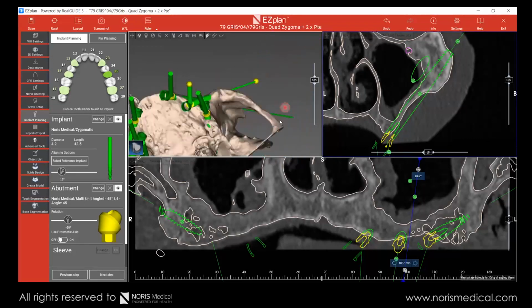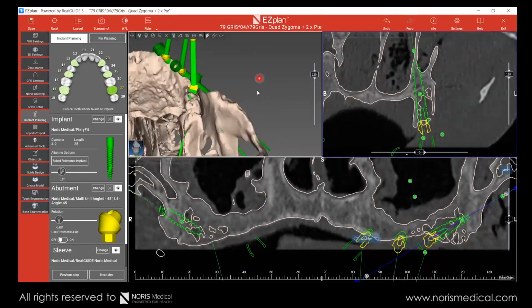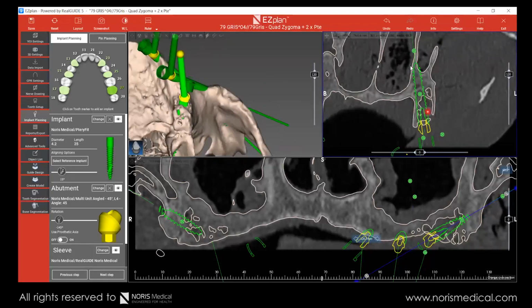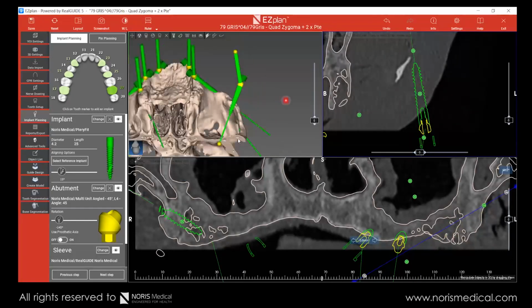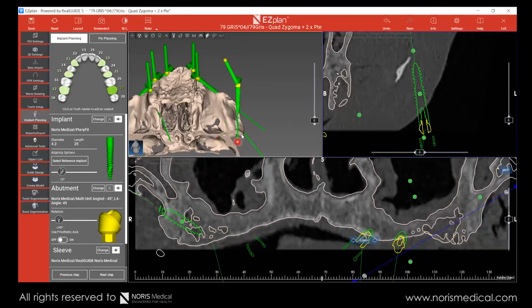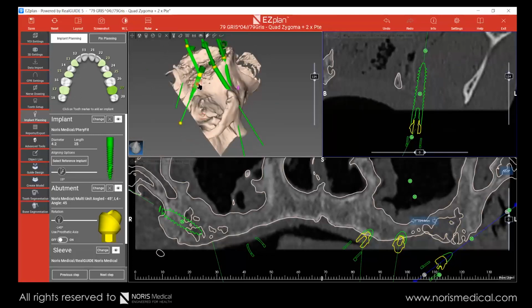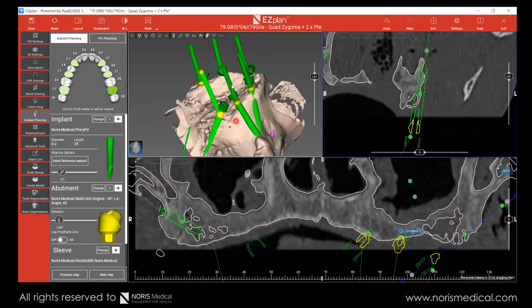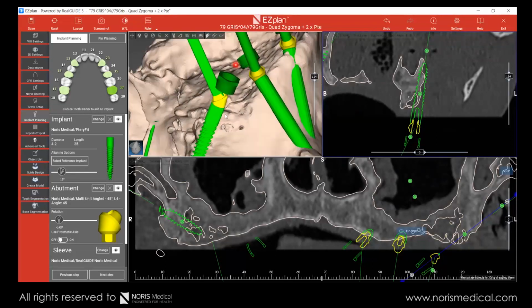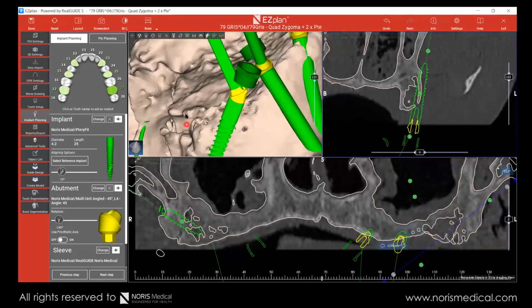Okay, let's look at the pterygoid we have here. You see this pterygoid here is actually now positioned towards the medial plate. Let's take the implant out. We took it out, and I'll just move it around, so we'll see what to do. So this implant right now, first of all, I'm going to position somewhere about 10 millimeters from the tuberosity, something like that.